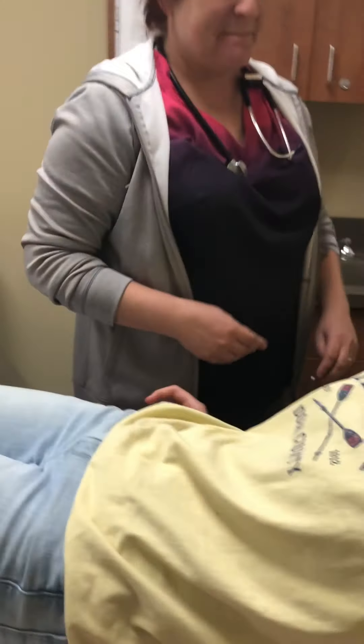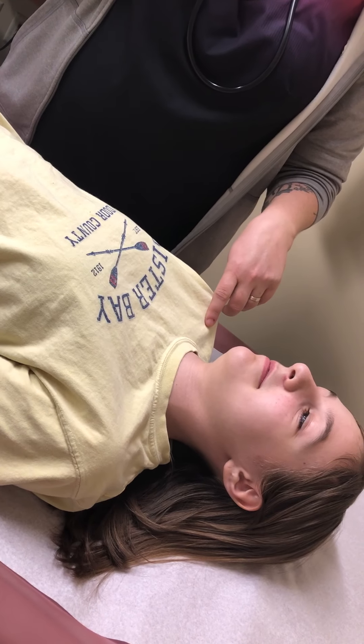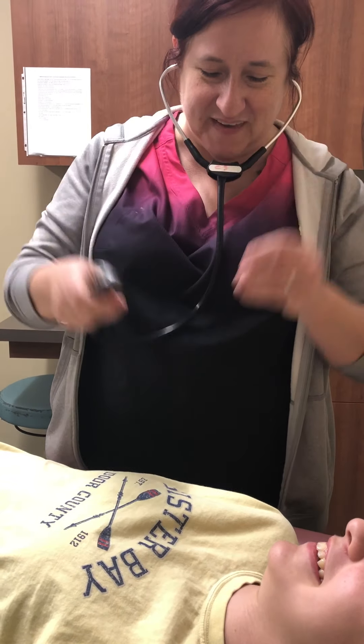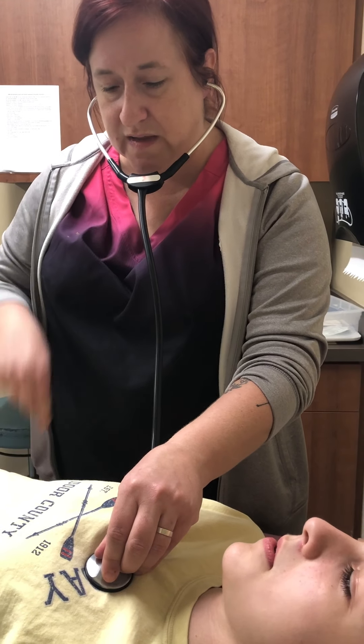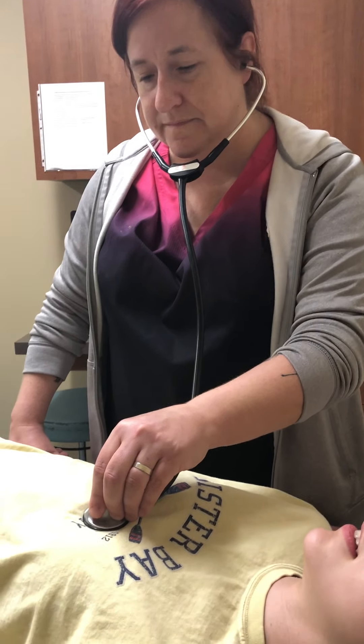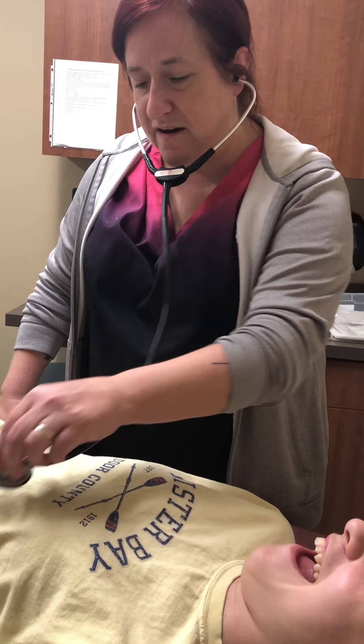We're going to have you lay back so we can do the cardiac exam and the abdominal exam. At this time you could notice if she had any jugular venous distension, which she does not. Find the points to listen to the cardiac valves. Here's her clavicle, the first intercostal and the second intercostal — I am listening to the pulmonic valve. Then I go across and listen to the aortic valve. Then you go two intercostal spaces down for the tricuspid, and then across for the mitral.